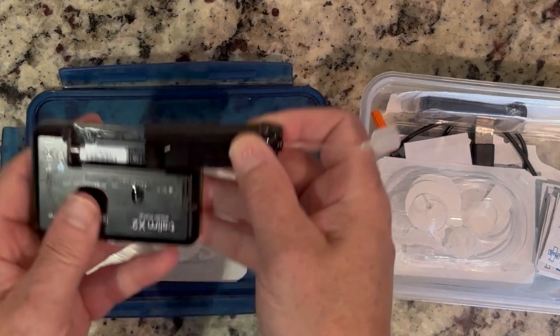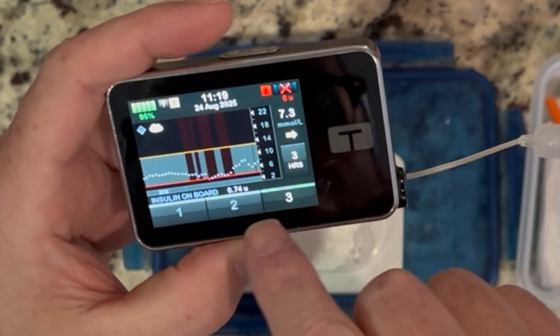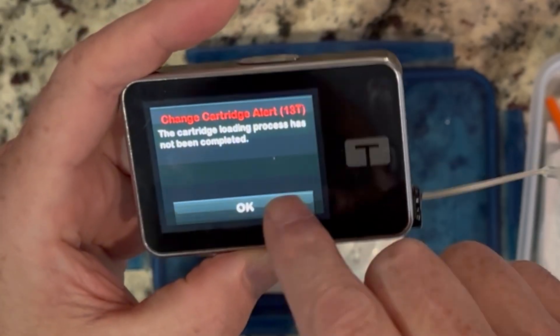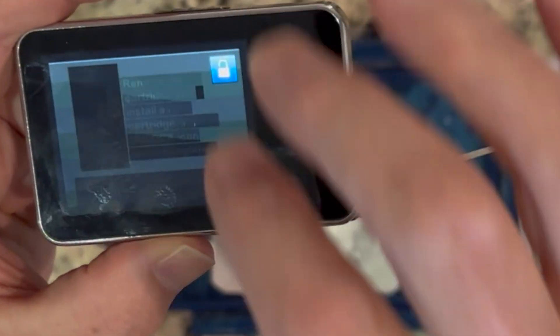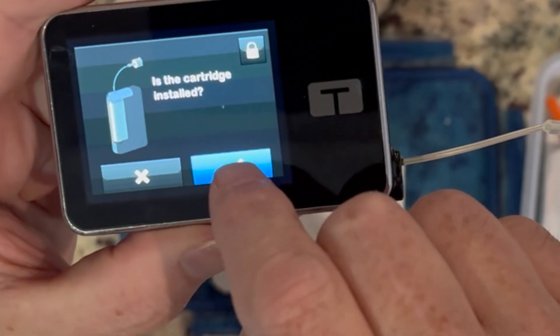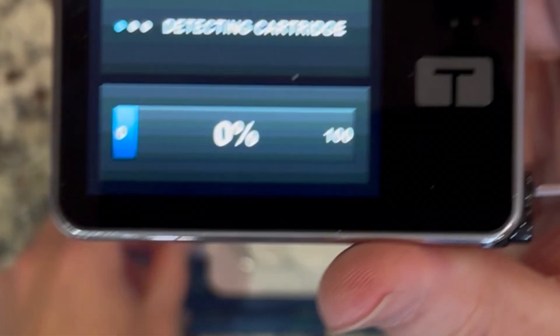Slide the filled cartridge into the pump — you can't really do this wrong. It smells like insulin; everybody knows what that smells like. Turn it on, then hit remove cartridge and install filled cartridge, then tap the little lock. It asks if the cartridge is installed — yes it is. And as you can see, it's now detecting.